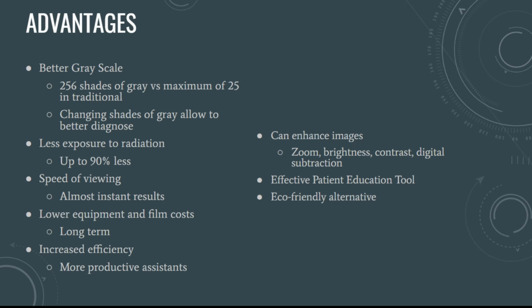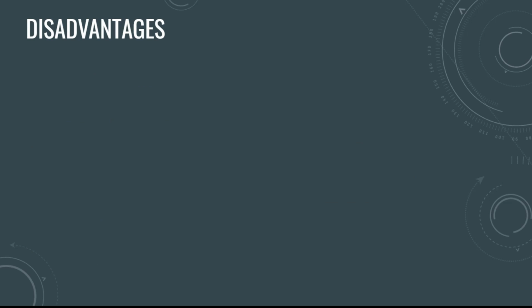And it's a slightly more eco-friendly alternative. Again, there's not as much waste because you're not using those traditional films that have the envelope and then the lead foil and then the black paper sleeve. And the chemicals. The chemicals can be very non-eco-friendly if they're not disposed of properly. And the disadvantages. The initial setup cost. Like I said, to set it up to start with, you're looking at a pretty hefty sum of money, but as you go through, you will see that your spending will significantly decrease.